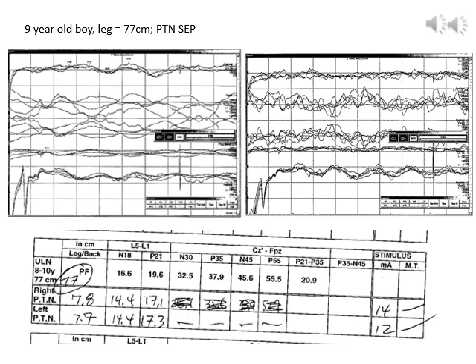Taking these two studies together, we can localize the dysfunction for this child. So the upper limb SEPs were entirely normal, suggesting that the peripheral conduction as well as central conduction from cervical spine on up to the cortex is normal. The lower limb SEPs show that peripheral conduction through the leg is normal. However, we're not sure if the signal enters normally into the lumbar spine or whether it travels normally up lumbar spine towards cervical spine. And so taking these two studies together, we can localize the abnormality between cervical and lumbar spine, and also possibly a dysfunction at the lumbar nerve root.